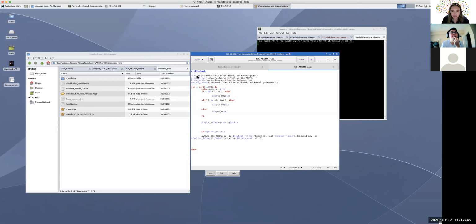This has the directory to your data, and then the AROMA folder, which, at least in our lab, is in the toolbox, so you don't change this one. And then the brain mask, you don't change this unless you want to use a different size brain mask for your data. And then you're also going to want to direct to the motion folder, which is the realign parameter folder from DPABI if you ran from there.